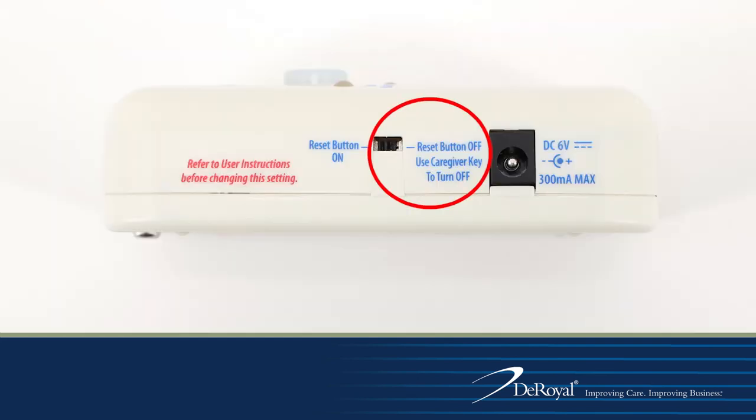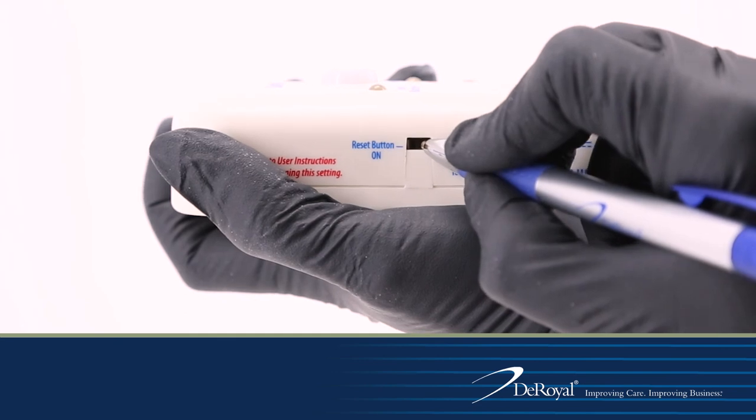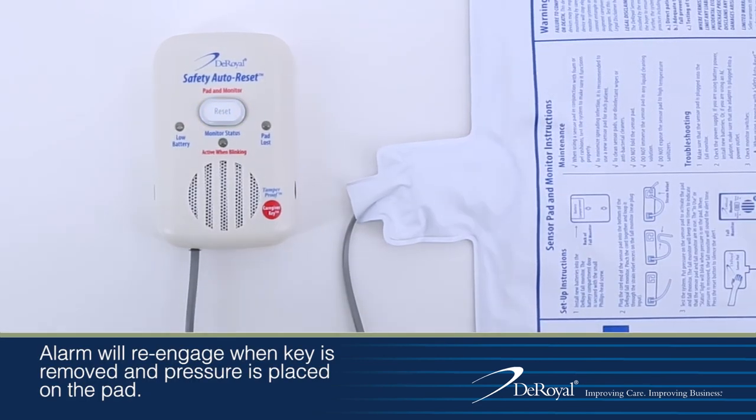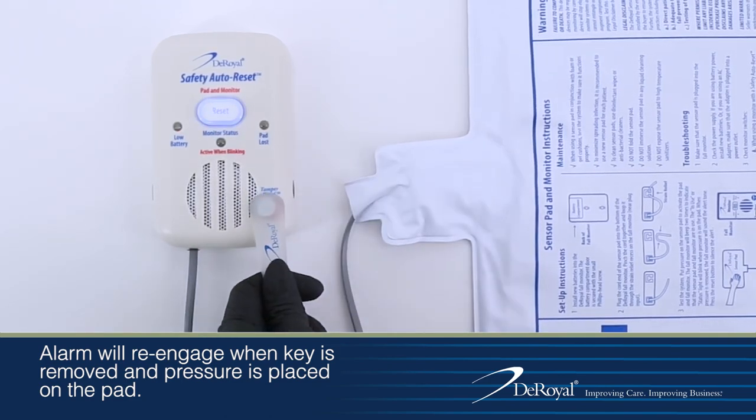To switch the monitor to caregiver key mode, locate the reset button port on the left side of the monitor and slide the switch to caregiver key mode. To test, release pressure from the pad and press the reset button. The reset button should not disengage the alarm.